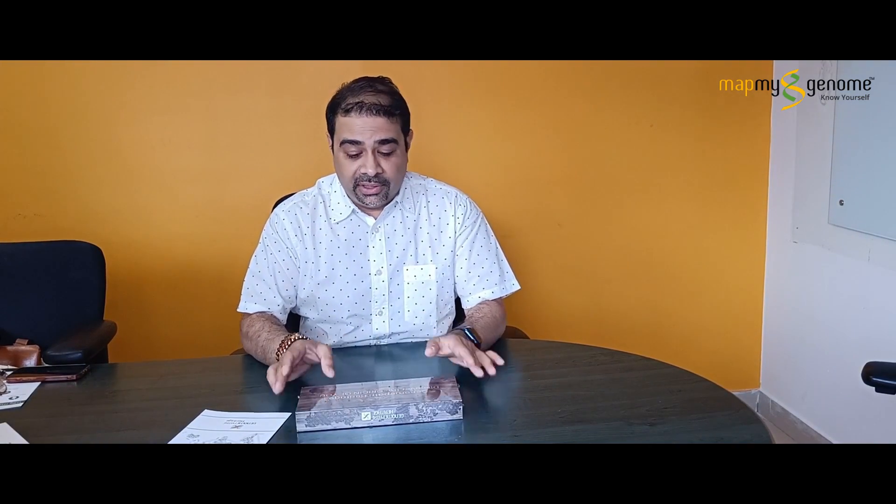Hi, today I'm at Map My Genome offices to discover the origin of you. I want to discover my genome patch tree. My family has an ancestry tree that goes back a couple of generations, but I'm intrigued to know more about this. So I'm going to unbox this and then start with the test.